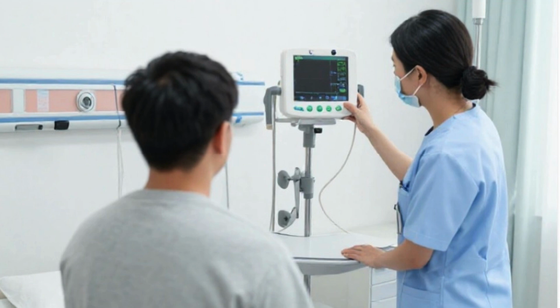3. In which hospital area are patient monitors most commonly used? A. Pharmacy. B. Medical library. C. Intensive care unit. D. Administration office. 4. What is one advantage of patient monitoring systems compared to single-function devices? A. Lower cost. B. Smaller size. C. Integration of multiple measurements. D. No need for calibration.